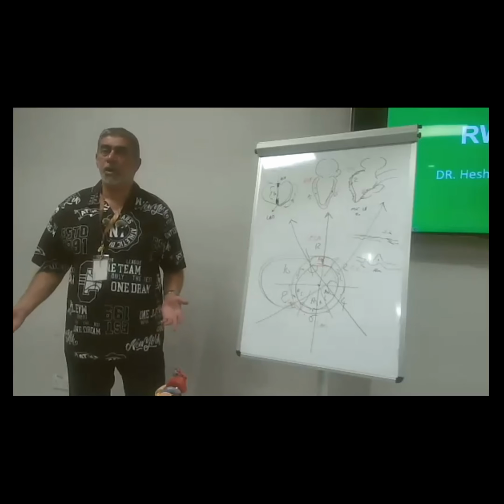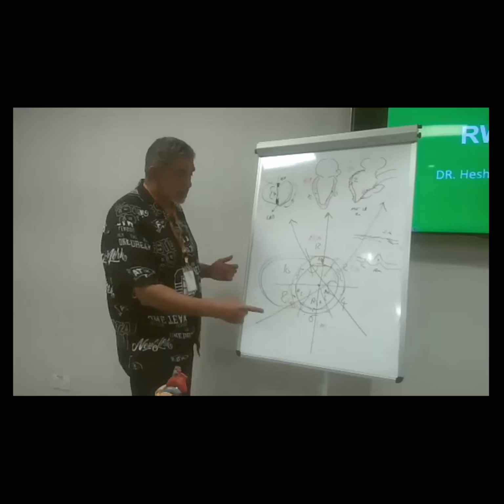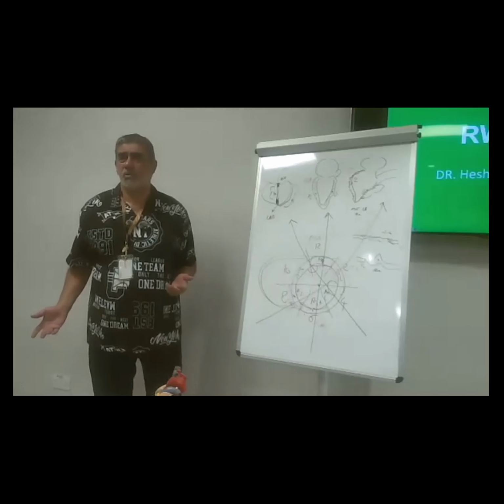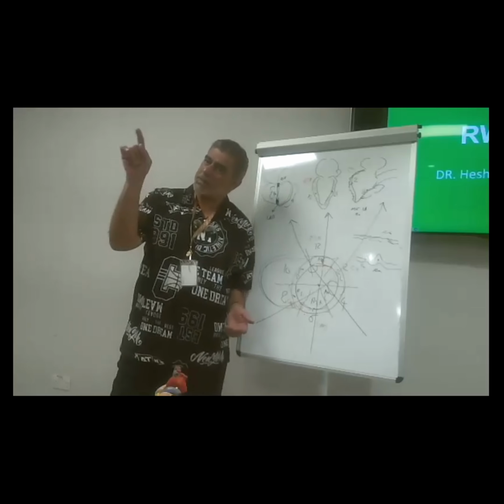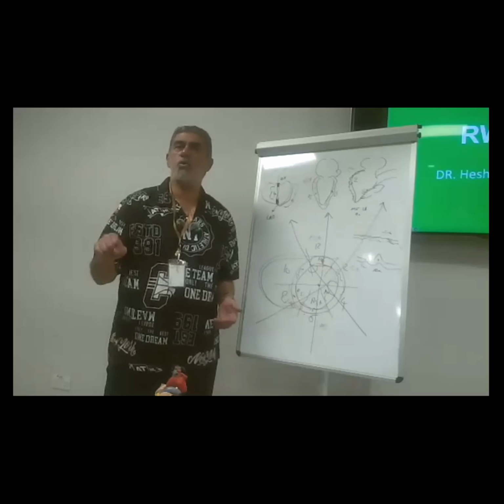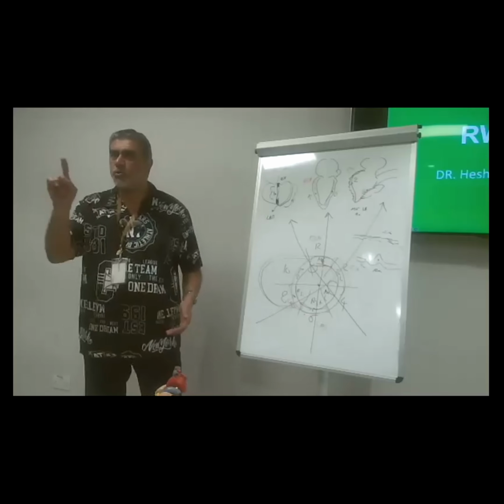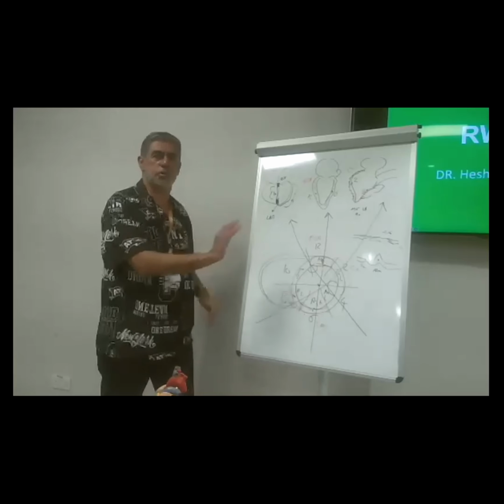So you may tell me that 6 and 8 were bad before, dear doctor. Why do you suppose this is an improper anastomosis? I tell you, yes, you are right. That's why you have to scan the patient in the pre-bypass time. Scan your patient in these four views. I'm happy if you do it in these four: 2, 12, 6, 8.